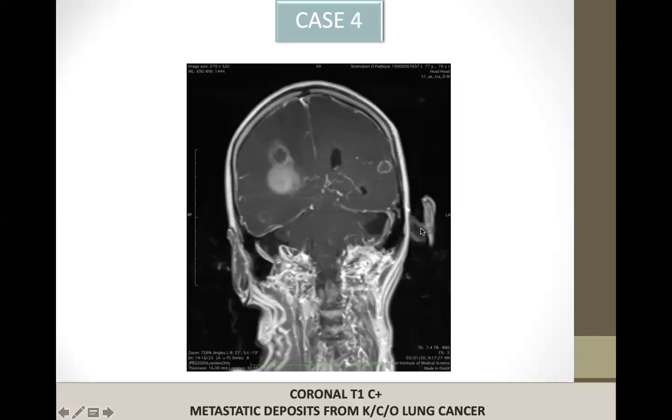This is a case of a patient with known lung cancer. As you can see, the patient has two metastases in both hemispheres.